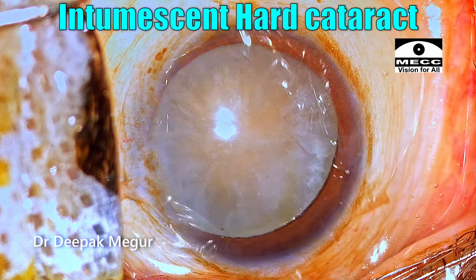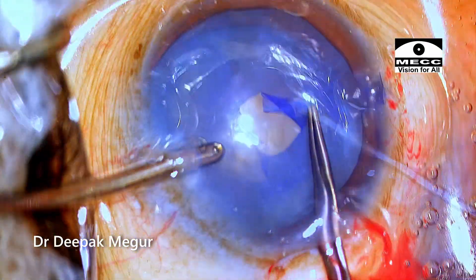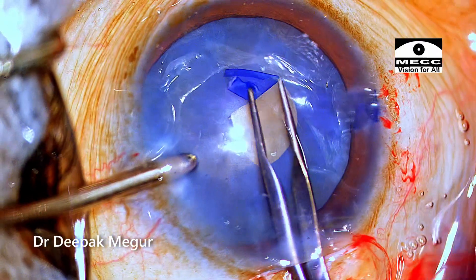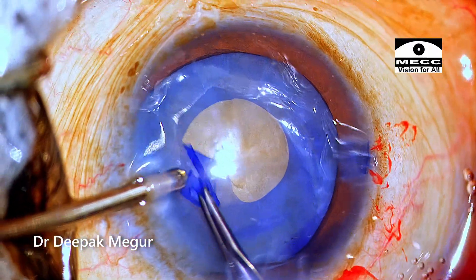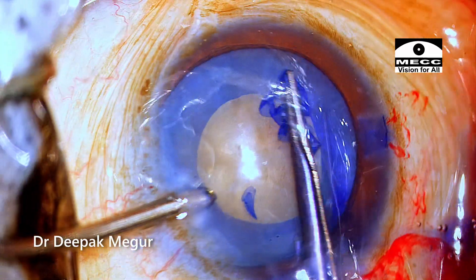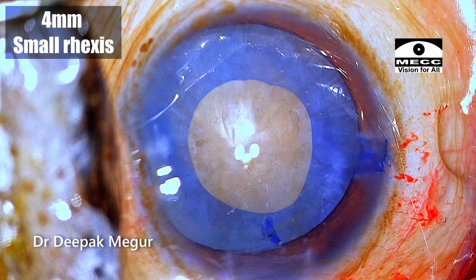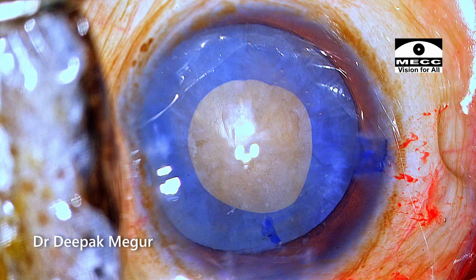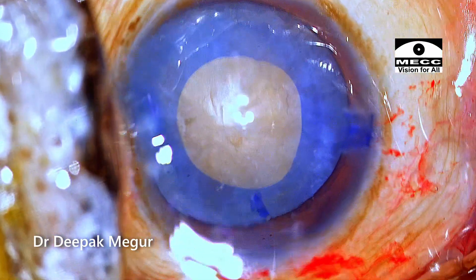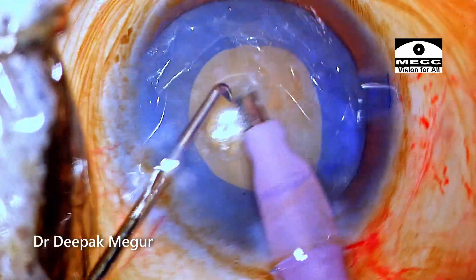Moving on to the second case. This is again a white cataract, and I was again expecting an intumescent lens. I begin by making a slightly smaller rhexis and end up with a rhexis of about 4 to 4.5 mm. The problem with this nucleus is that it is relatively denser — definitely much more dense than the first case. No hydrodissection; I'm going directly to the phacoemulsification process.